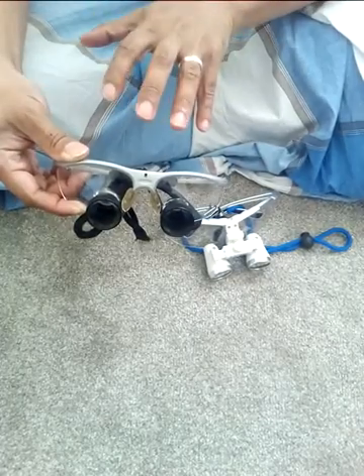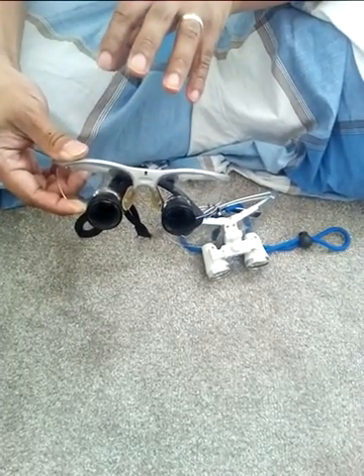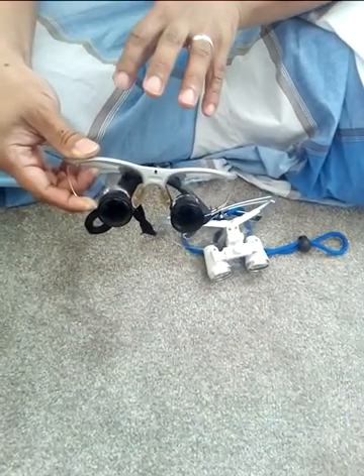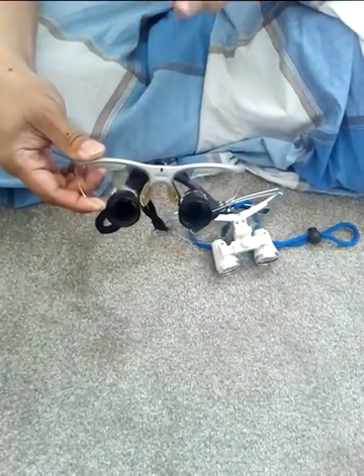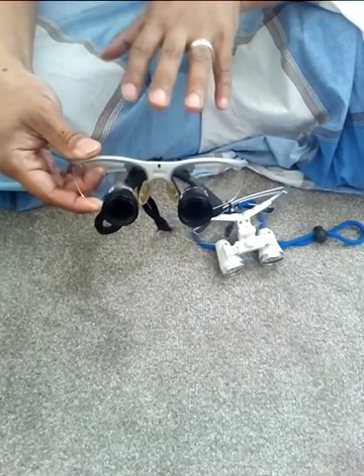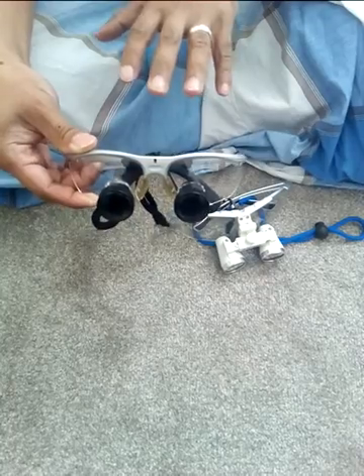This really works miracles because you spend thousands of euros or pounds to get a loop fixed on your eyes. But you can get the same quality, the same job that it does, at only less than 100 pounds, really.